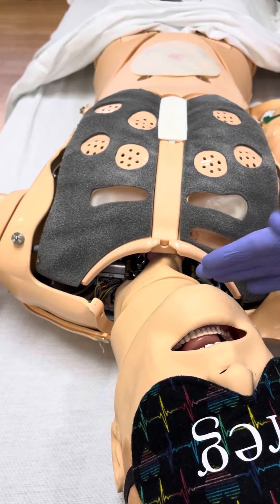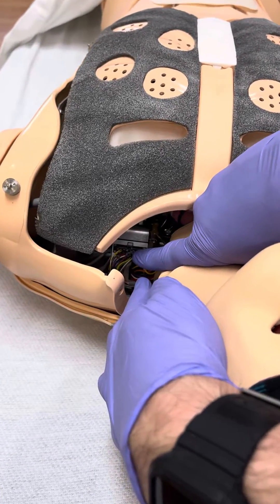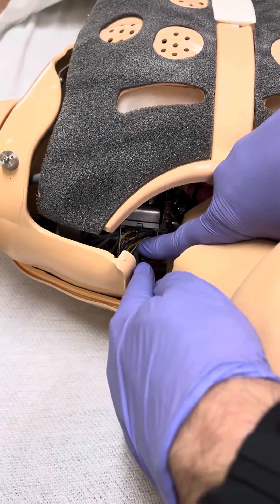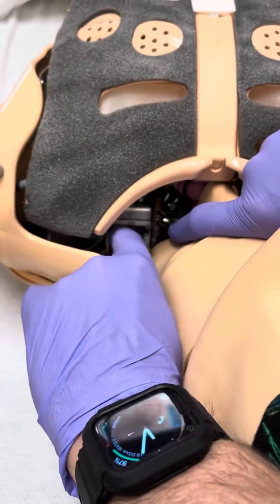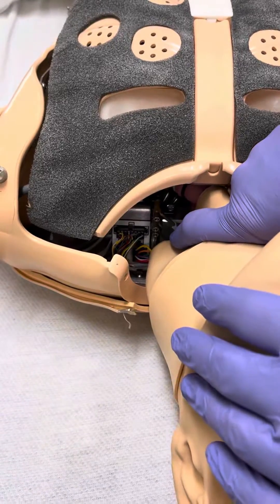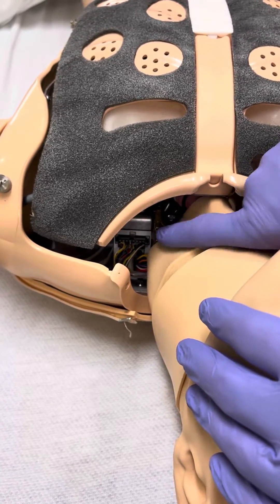The simplest thing to do is there's a wire loom down here on the patient's upper left shoulder. After you remove the skin with the two zippers, there's a loom of wires here. If you move the wires over to the left or down, 90% of the time that will actually fix your issue with the lung sounds not working.